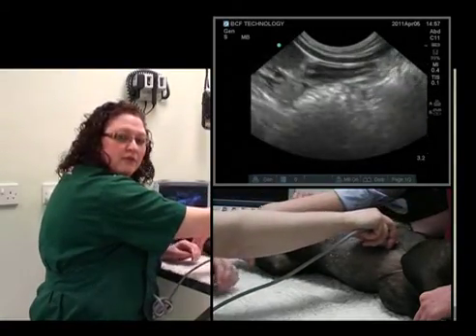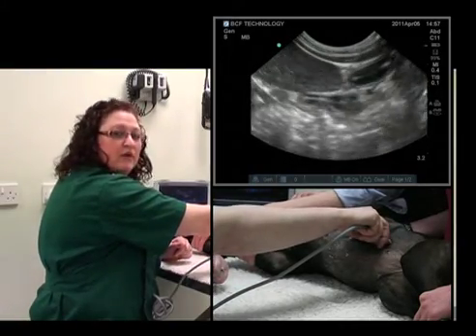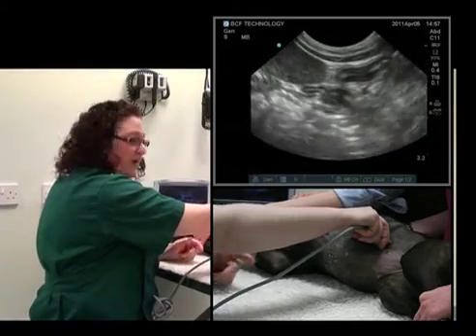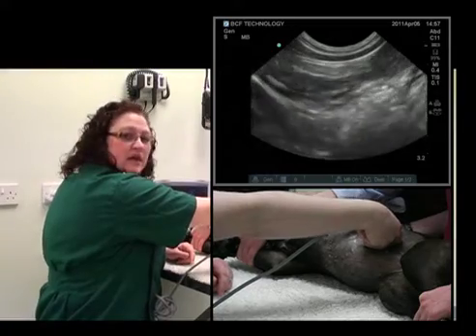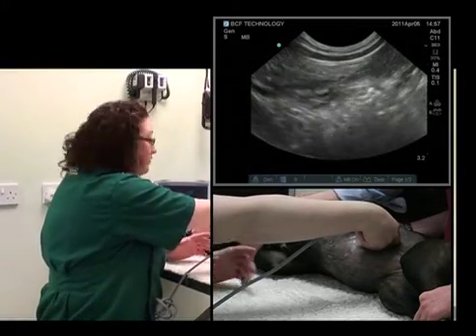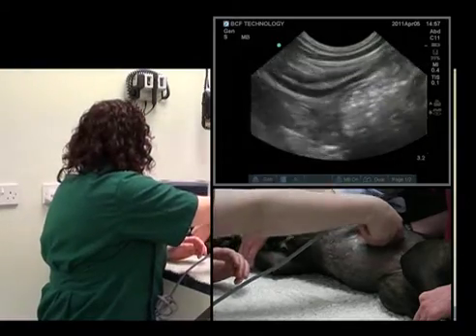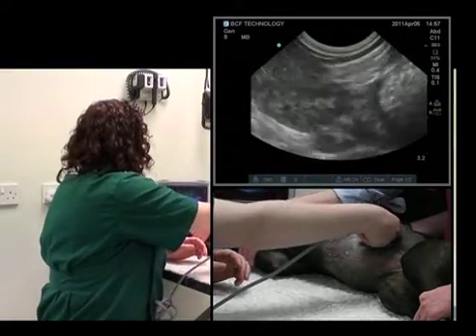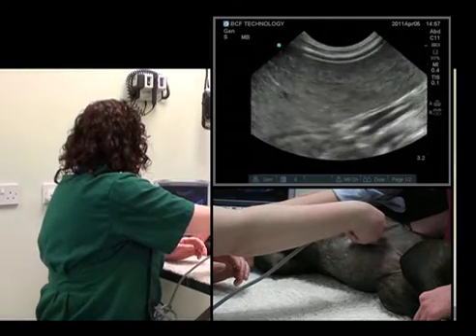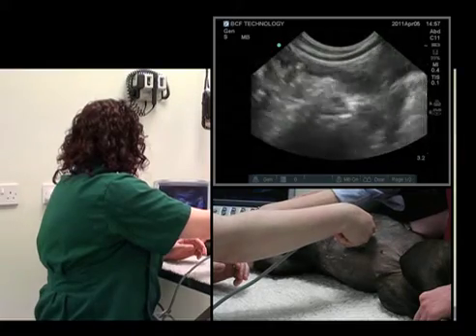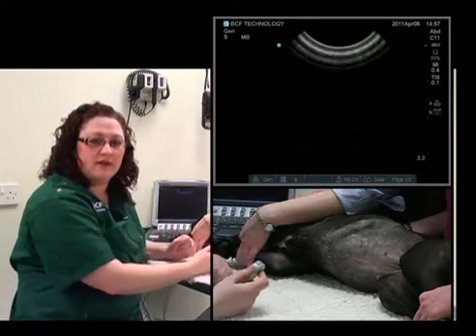Just like a radiograph, we want to see everything in two planes. So we'll rotate the probe 90 degrees clockwise and slide all along the portion of the spleen in a cranial direction. And we've seen the entirety of the spleen.